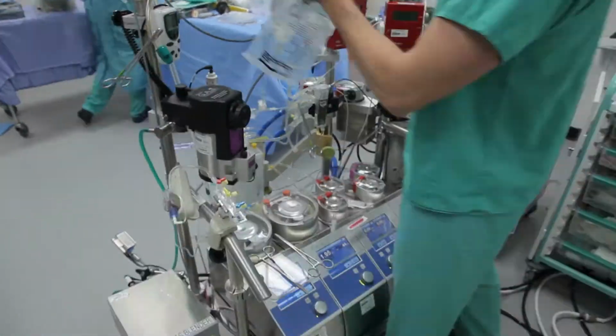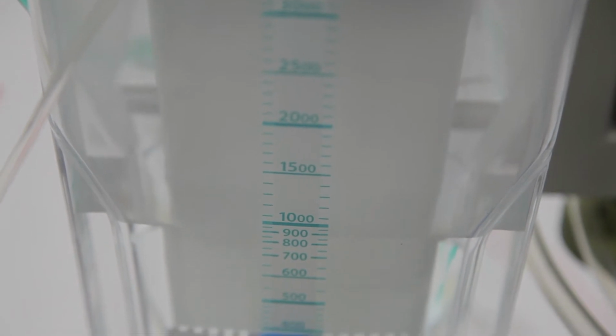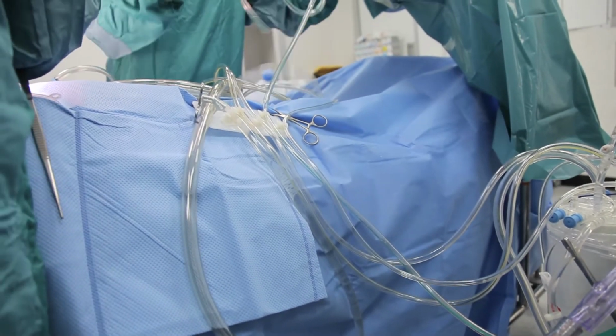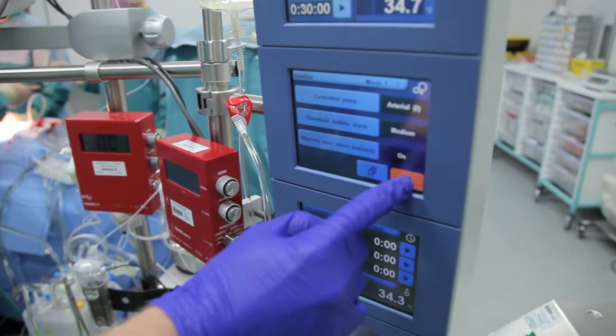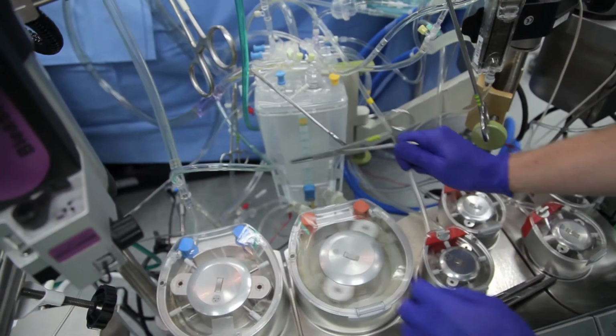And since we don't have a sash and we prime lines handed down from the table, we fill up the reservoir up to 900ml. So once the lines have been handed down, we circulate up to the table, turn the bubble sensor on and circulate at 7 litres a minute for 5 minutes, and tap all the connections again to make sure there's no air.